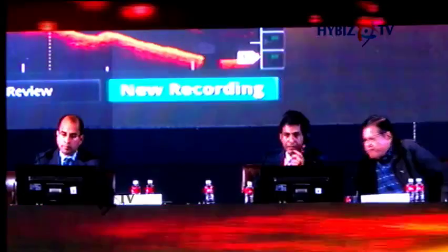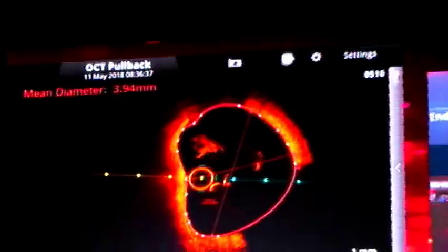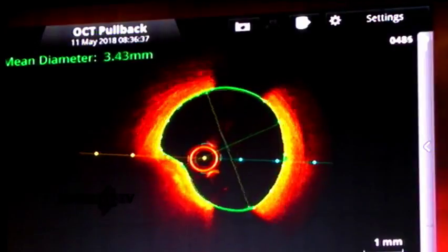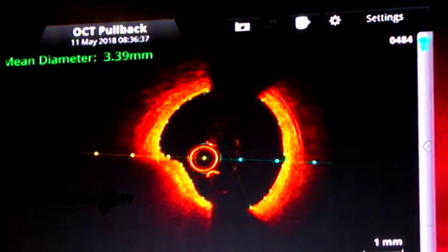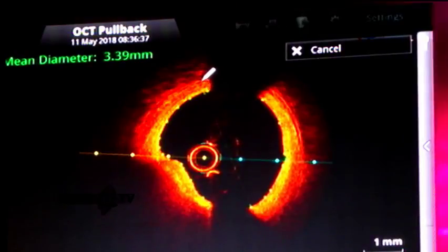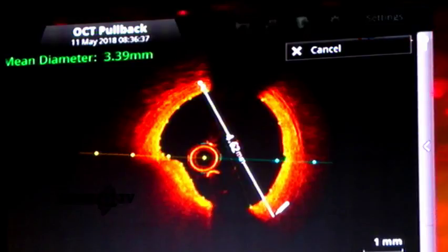So we'll take a 3.5, and why do you want 4.5? Any specific formula, like with OCT, if you see 3.87, you have to add something, like add 0.5 or something like that? 4.6. Yeah.